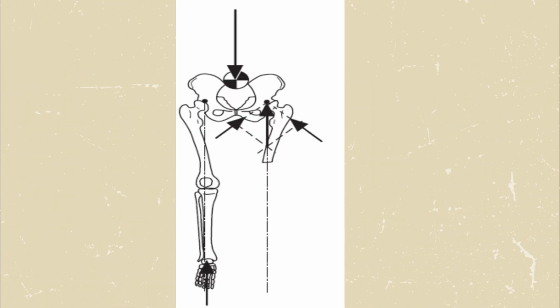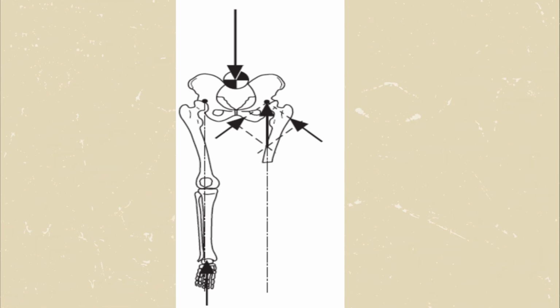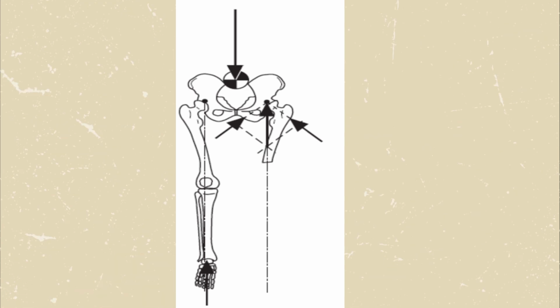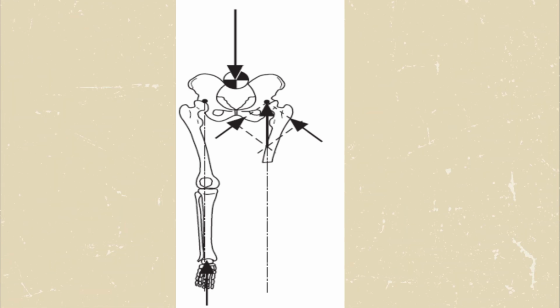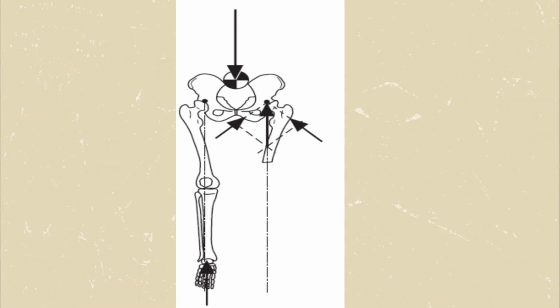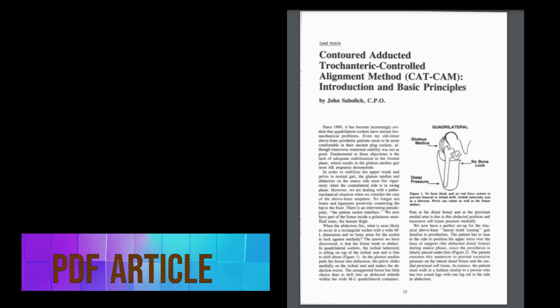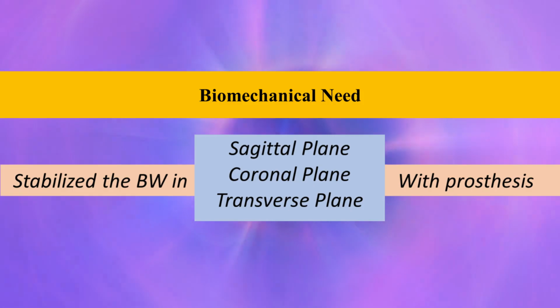Weight is transferred from the conical shape around the ischial tuberosity. Medially, weight is transferred from the IT. Laterally, weight is transferred from the subtrochanteric area. This creates a narrow mediolateral dimension, and the resultant weight transfer force passes through the hip joint. An article is available online for full details.